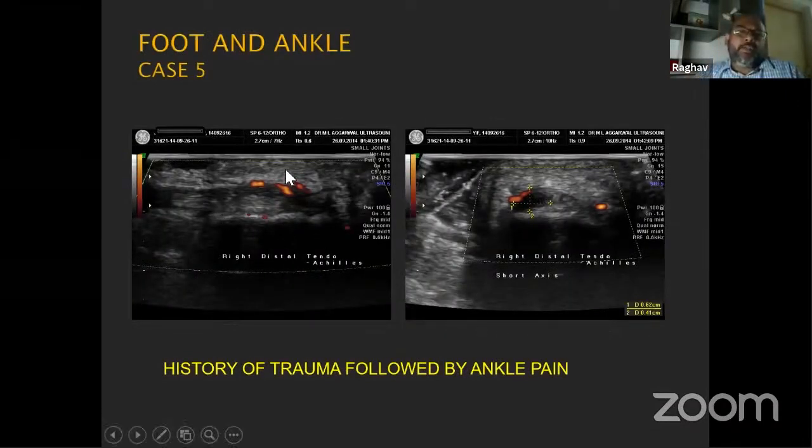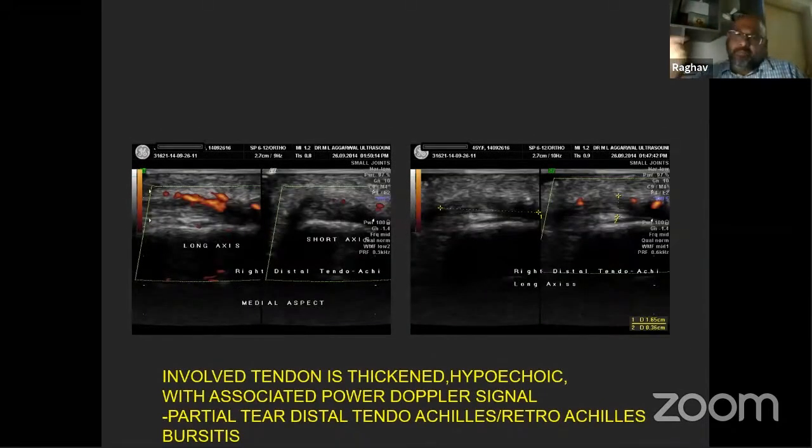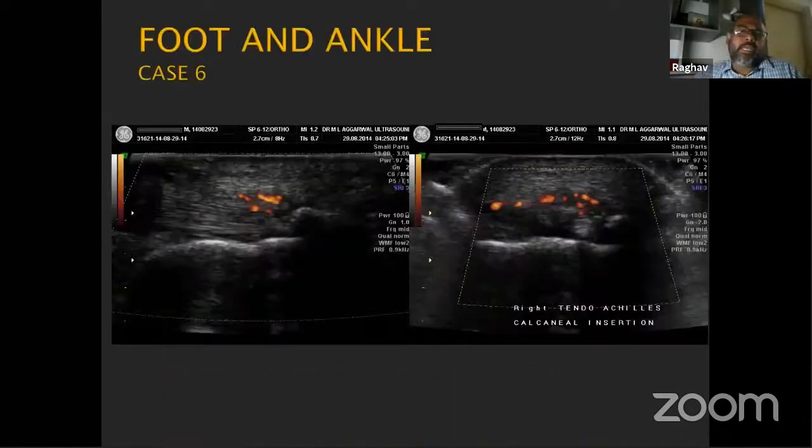This is a patient again of tendo-Achilles, as I think Dr. Nafisa had said that for the tendo-Achilles, ultrasound is an excellent modality. We can see a hypoechoic tear here with inflammatory vascularity along the superficial aspect. So on the ultrasound, we can actually see a tear and do a compression, decompression, and actually see whether it's a tear or a tendinosis. Additionally, the MR might be useful, but it has to be a cocktail of investigations which can just answer the question asked there.